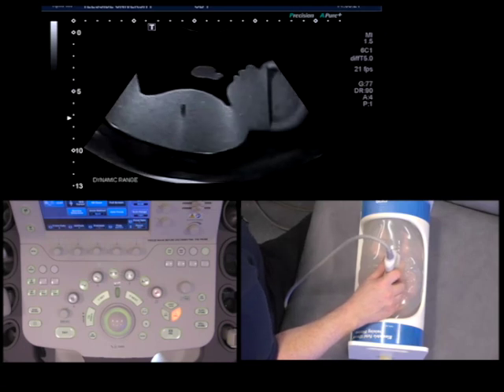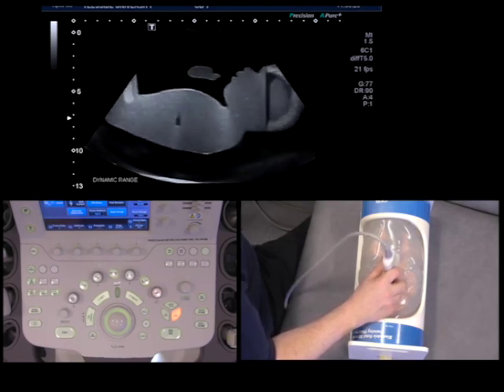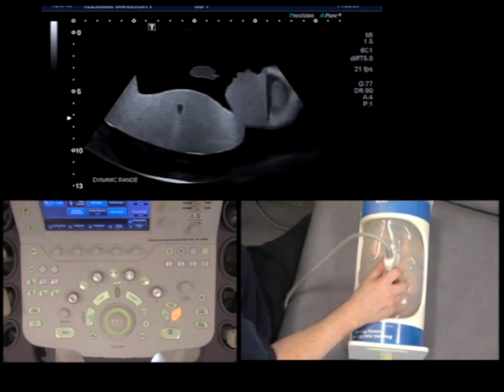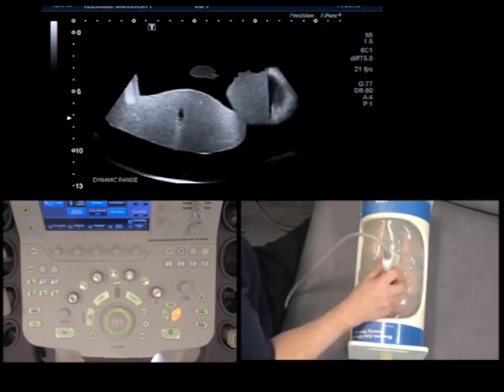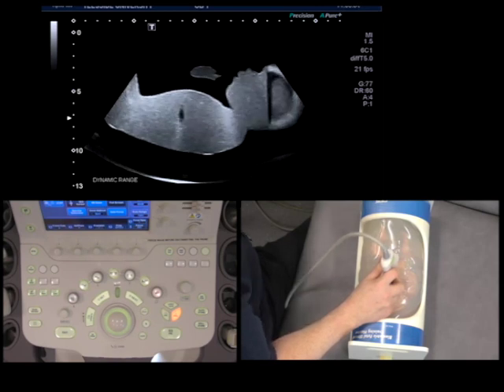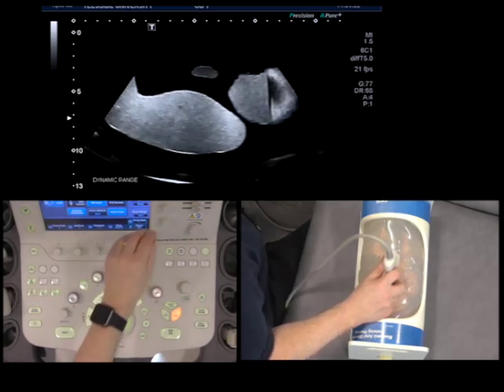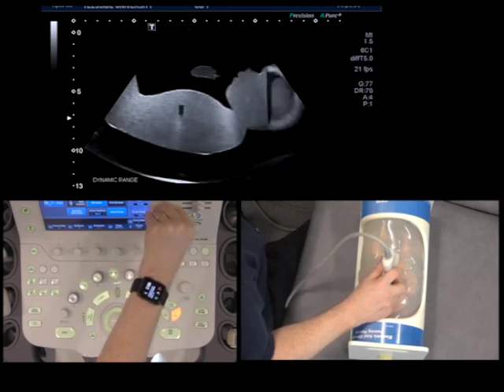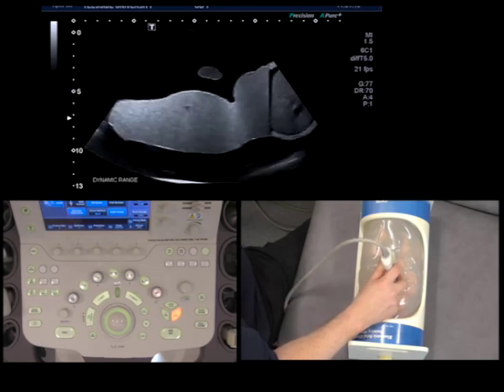In reality, the dynamic range is a bit like the political spectrum. You don't want to be at the far right or the far left — what you want is either side of the centre. Dynamic range is pretty much exactly the same. If you want to look at borders, put it to the black-and-white side of centre. If you want a wide shade of greys, move it to the wider side of centre. Moving it toward centre gives a nice trade-off between seeing shades of grey and being able to differentiate borders. And that is dynamic range — and the end of this video.